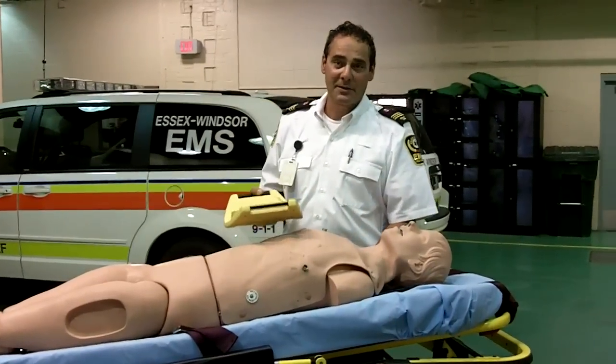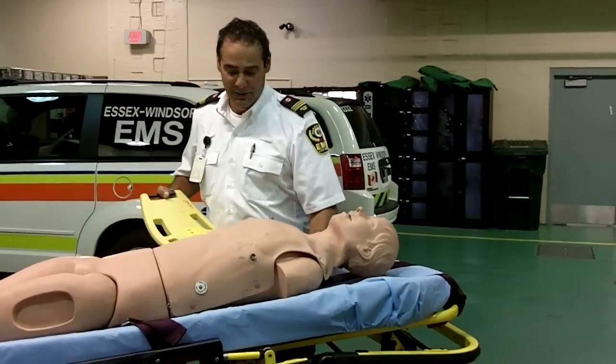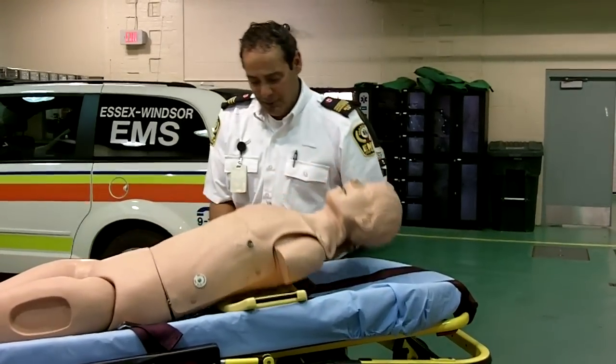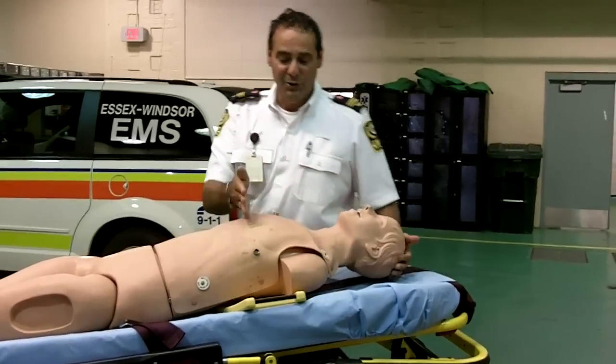I'd like to introduce you to the newest piece of equipment at Essex Winsor EMS: the Lucas II, the automated CPR machine. We have a back plate that slips underneath the patient just below the armpits and in between the nipples.